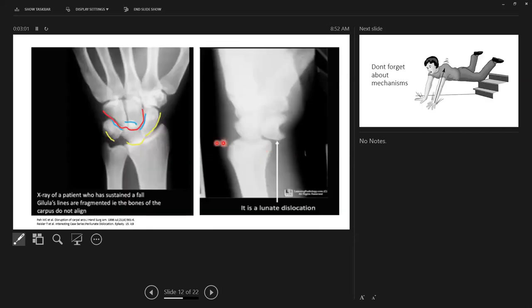In this patient, you can see a disruption of the carpal arc on the first one, and the second one also is not very smooth. You can see overlapping of the third arc actually. When you turn over to the lateral view, you can see a spilled cup sign. This is a lunate dislocation. You need to do reduction in the ED.